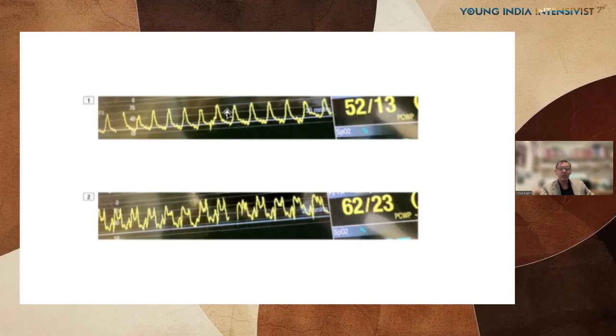And number two, and this is critical in my practice because I work in the CCU with cardiologists and with heart failure patients that we are evaluating for transplant, you have to be able to get the wedge correctly to measure the pulmonary vascular resistance correctly, right? And that is the end diastolic pressure, not the mean left atrial pressure. So that is the reason to pay attention to the tracing.